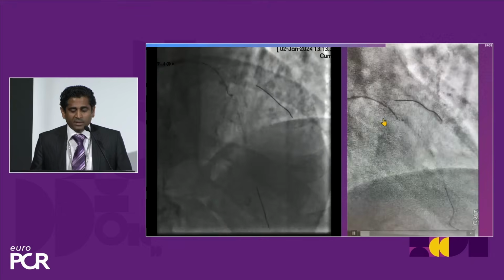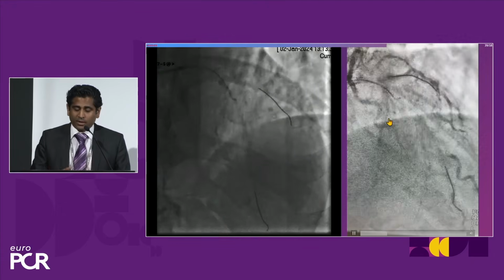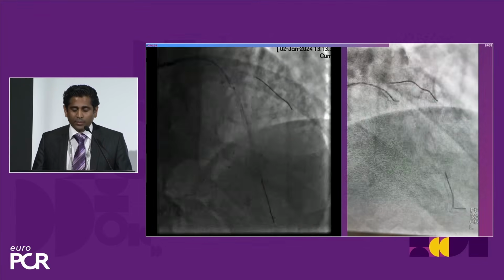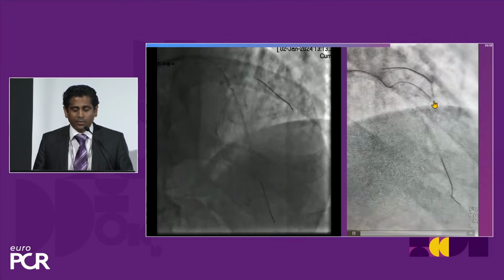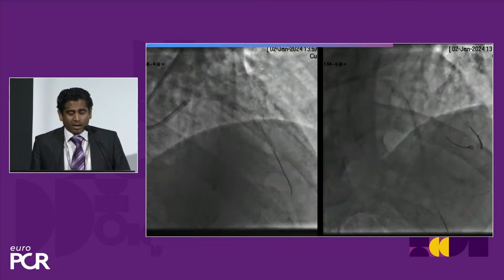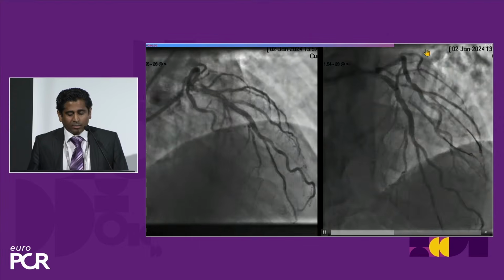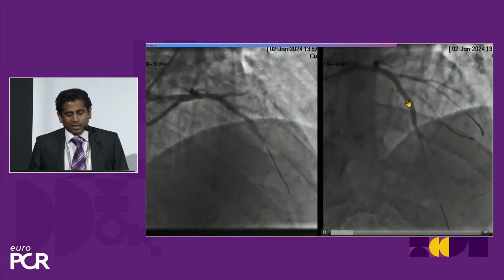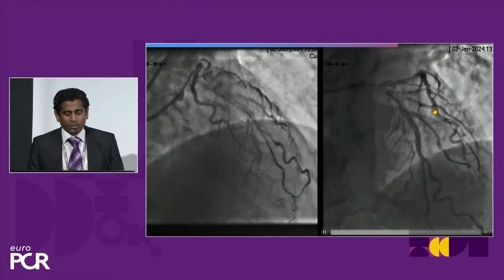So luckily we have these angulated catheters, which are super, which you can point right at the ostium of the diagonal. And you could see here I've taken a fielder XTA wire and I secured the diagonal. After that, I used 2 DCBs in the diagonal and stented the main vessel. And again, look, this is the final picture. I know there's a linear dissection there in the second diagonal, but TIMI 3 flow. Okay, so I didn't want to intervene.